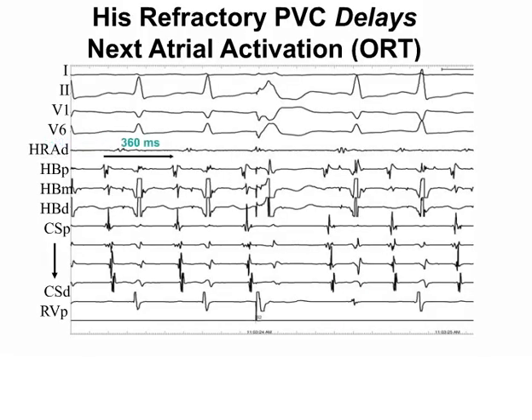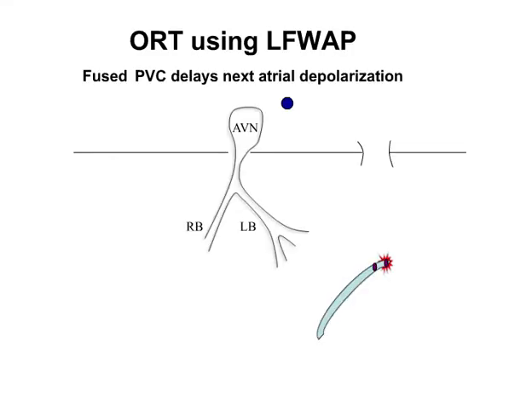And then finally, when you bring in a PVC on the His and you delay, look how much later that next A came. Atrial tachycardia is not going to do it. You can't delay atrial tachycardia by putting a PVC on the His. This is another diagnostic finding because what happened was, instead of terminating in that pathway, you reached it, it's decremental, and when you reach it early, conduction slows through that pathway dramatically, and so the next A comes later than expected. Post-excitation, some people call it, but again, it's diagnostic. Termination, advancing and resetting, or delay are the things you look for.